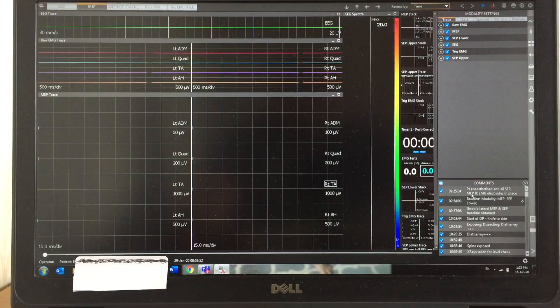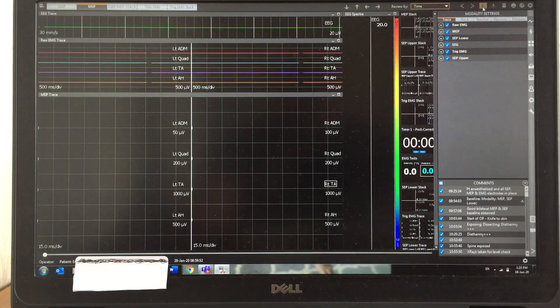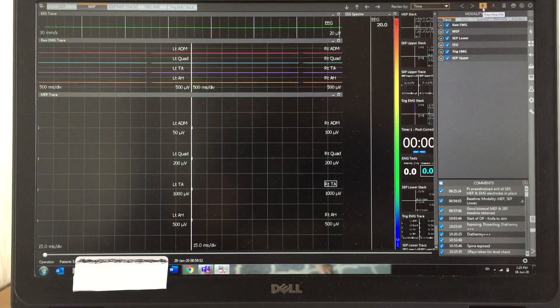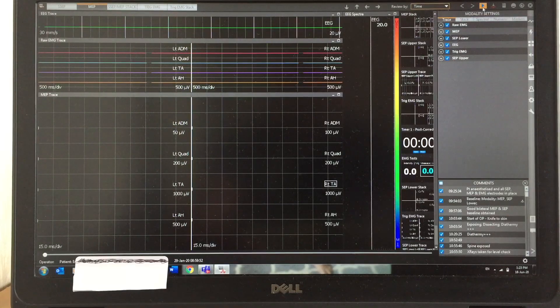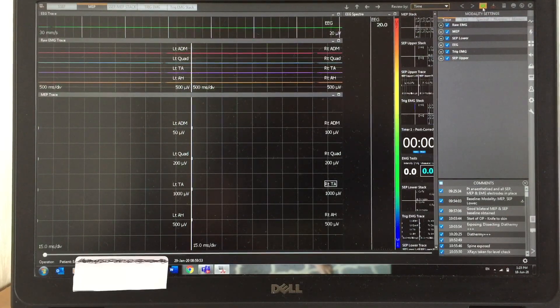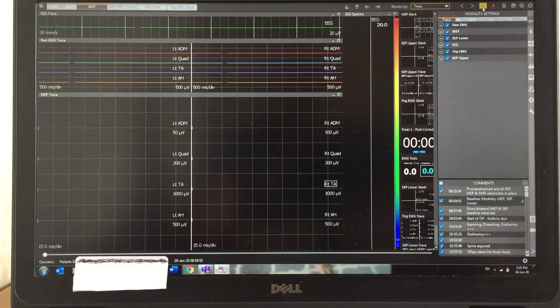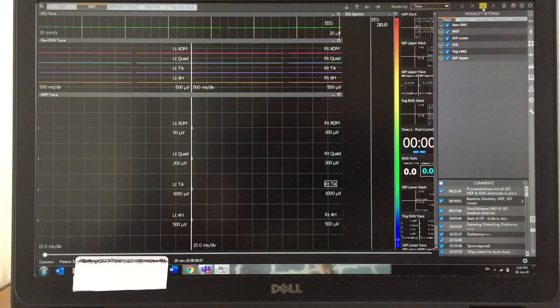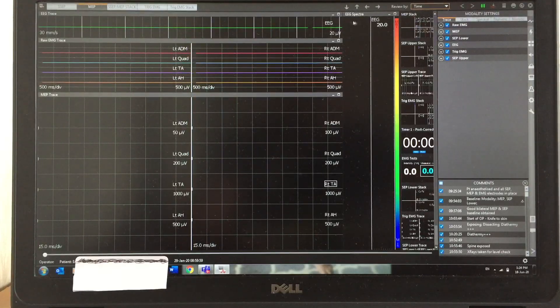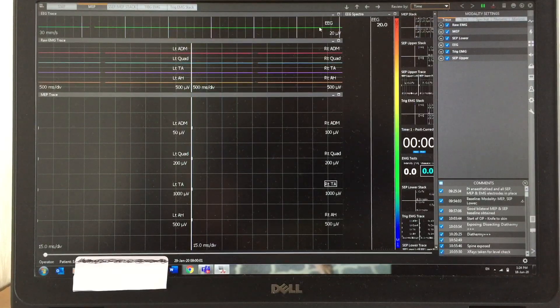I'm going to start running this, that is reviewing the data. So I need to hit this play button. As soon as I hit the button, you can see the traces are moving. The top one is EEG trace.